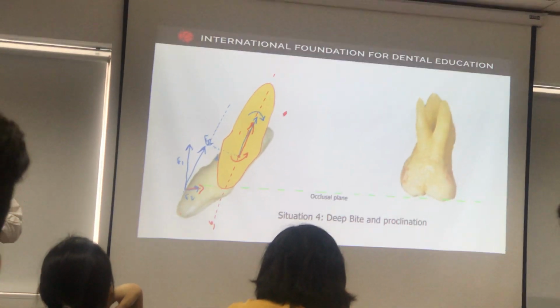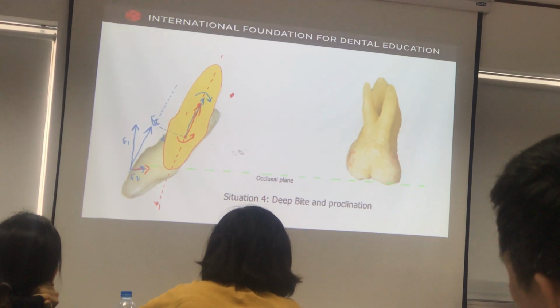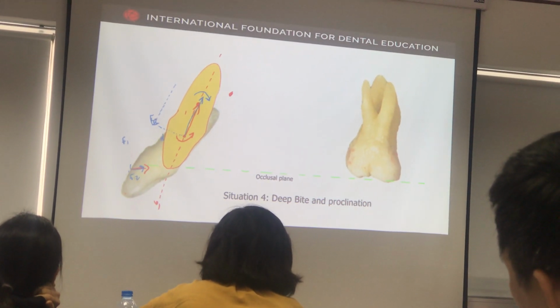Như vậy thì ở đây là tôi cần phải làm cái moment để xoay cái răng, chứ tôi không cần phải là cái lực chỉ có tịnh tiến. How can you do that?